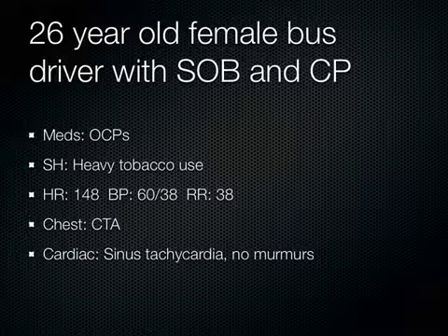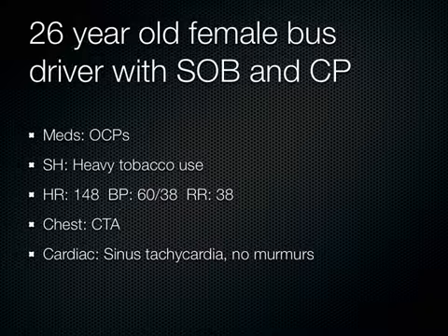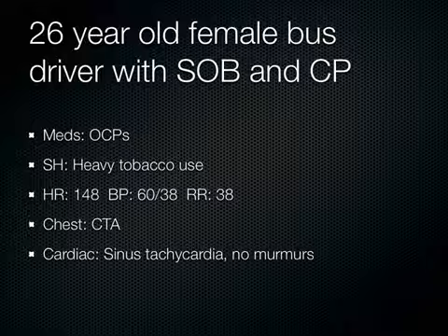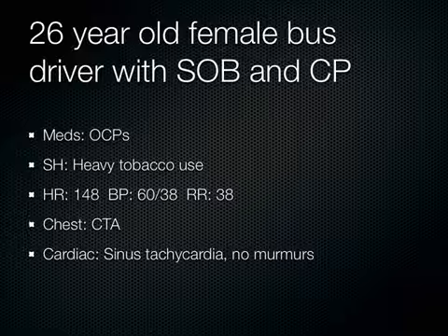Normally you've got the left ventricle and you've got the right ventricle. The right ventricle is about 2/3 the size of the left ventricle, correct? You with me? So what happens during a massive pulmonary embolism to cause this derangement of vital signs? The right heart gets bigger than the left heart. So if I had a patient who's unstable and I thought they had a PE and I couldn't get a CAT scan to confirm it, I'd push thrombolytics, because thrombolytics are indicated in shock, okay?